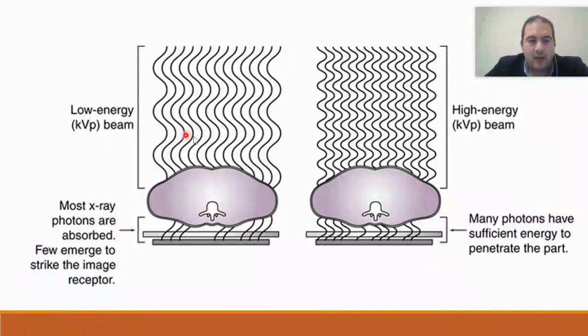In this scenario, let's consider a situation where you are utilizing low kV, which stands for low kilovoltage. As a result of using low kV, the quantity of the output will naturally be on the lower side. This is because low kV is designed to operate with lower energy levels, which inherently limits the amount of output it can produce.